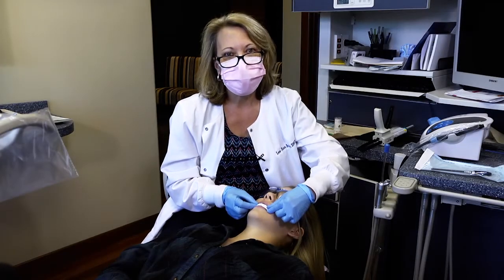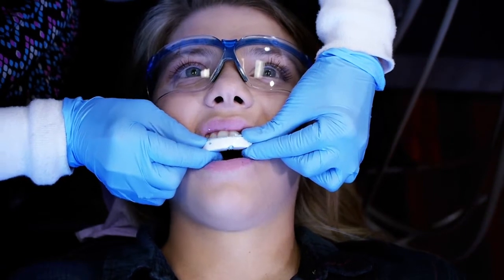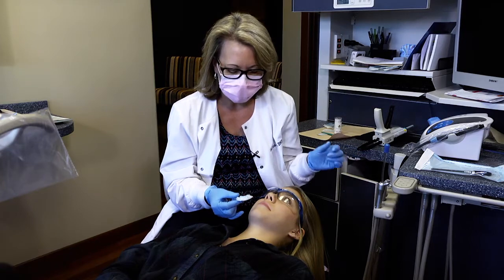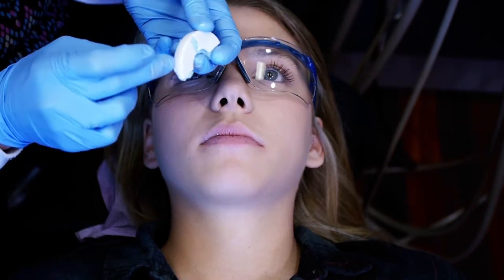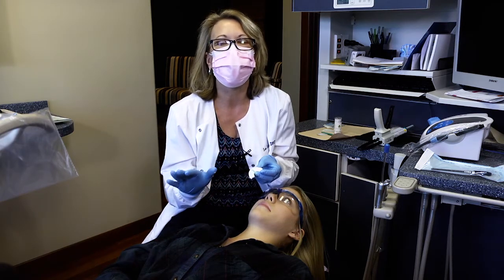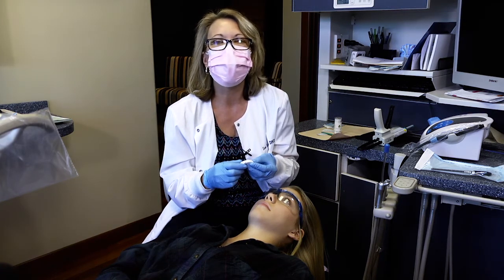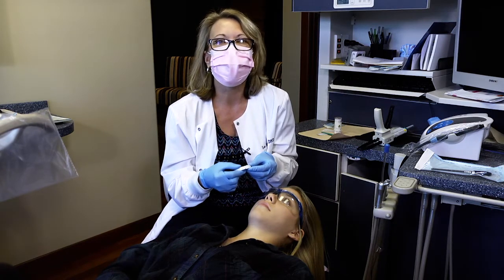Now that the bite registration material has set completely, I'm going to ask Jenna to open her teeth. Once she opens, I can pop this off her upper teeth and I've got a relined quick splint. If Jenna has material between her teeth, we can floss her teeth to get that out. Next I'm going to trim off the excess material on the quick splint — I don't want to carve it out of the retention areas, but I want to trim it back so that when Jenna moves her bottom teeth into her excursives, she's not getting stuck on the bite registration. We do that with a disposable blade.